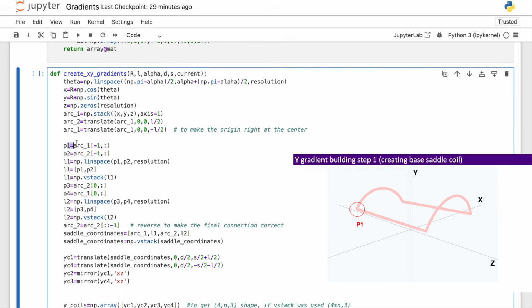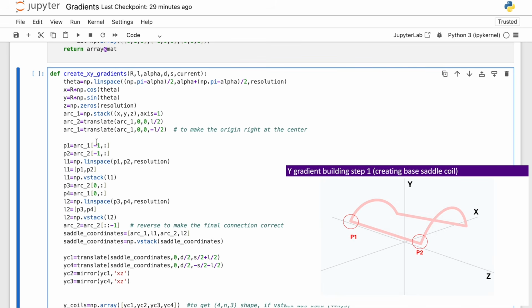Then we define point 1 and point 2, which are the first points of arc 1 and arc 2, which we then just connect using the linspace function, or we can just simply have them in an array. Why I have the two equations for the same L1 is because for visualization this produces better results, like we get more points. But for Magpylib, this is more than enough. We just need the 2 points to define a line. So for Magpylib, I will just comment this part. But for general visualization, I will comment the bottom part.